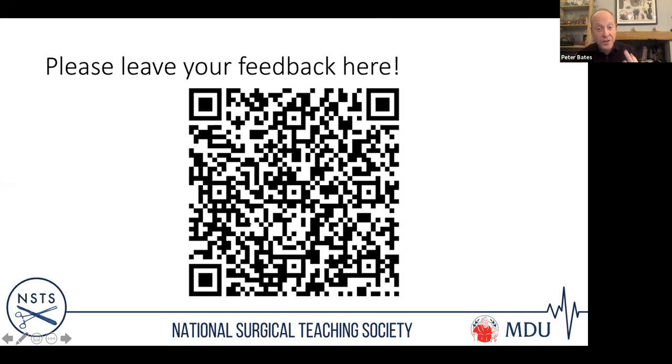The other thing about uncemented: you've got your long tube of your femur and you're jamming this thing into it. In order for uncemented to work, you've got to whack it in quite tight. It's got to get a good grip fit in order to work. Ultimately the bone ends up bonding to it, anchored to the bone, but that takes about 6 weeks. It doesn't happen instantly. So you want it to grip really well to begin with. And what can happen, particularly with very fragile bones, is you go whack, whack, whack, ooh, and you break the femur as you put the uncemented in. So uncemented has a slightly higher complication rate because you have more fractures when you're putting it in.